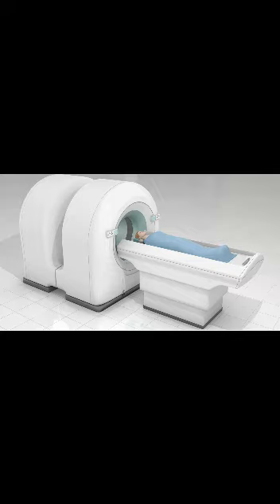What does it mean when lymph nodes light up on a PET scan? PET scans detect the rate at which cells are using sugar. When the scan lights up brightly, it means there is metabolic activity. Most aggressive cancers light up brightly, but the caveat is inflammation in the body also lights up because inflammatory cells are also metabolically active. Can a PET scan detect autoimmune disease?